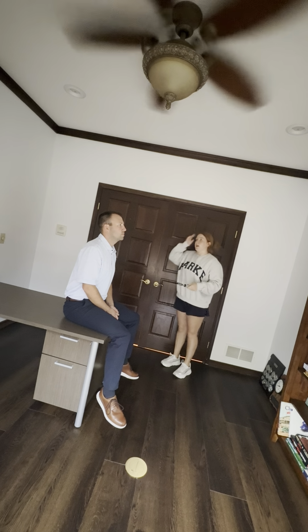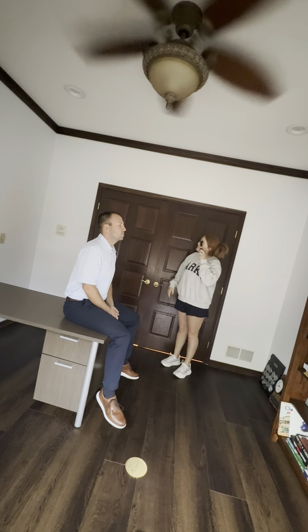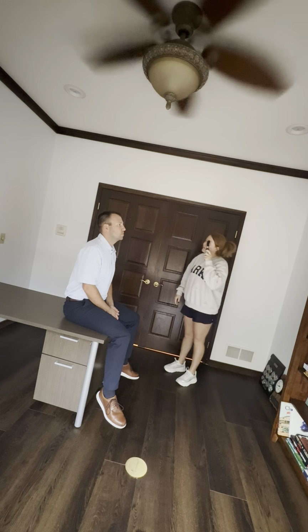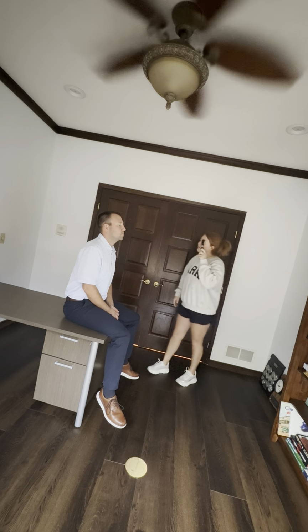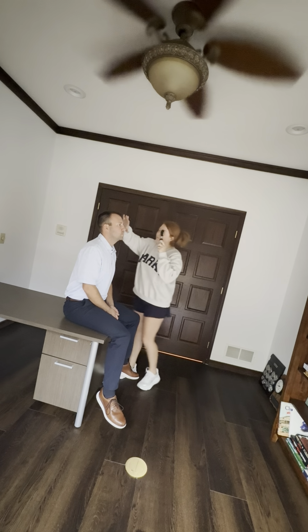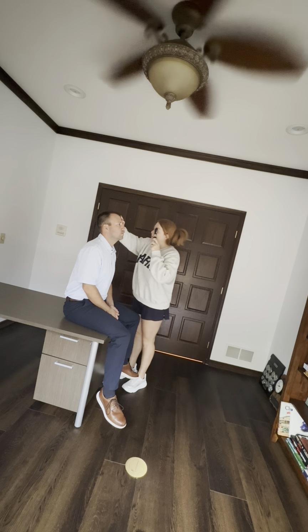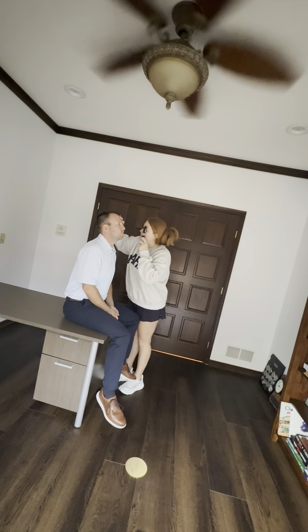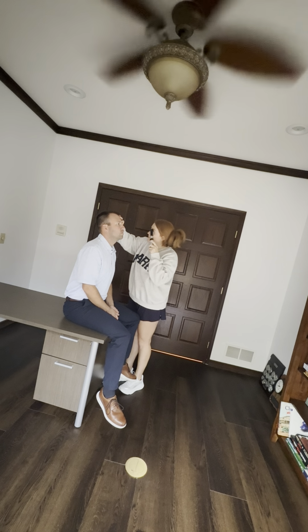I'm going to use my left eye and find your red reflex again. Just keep looking at that spot for me. I'm going to follow it in. Again, you're going to feel me on your head, and I'm going to get close. Lost it.